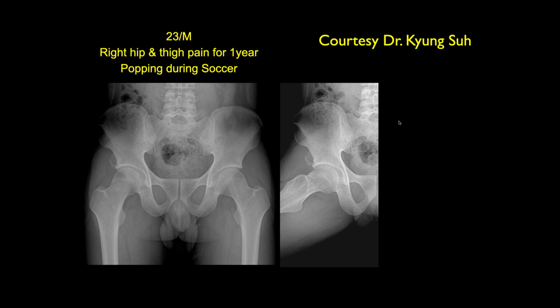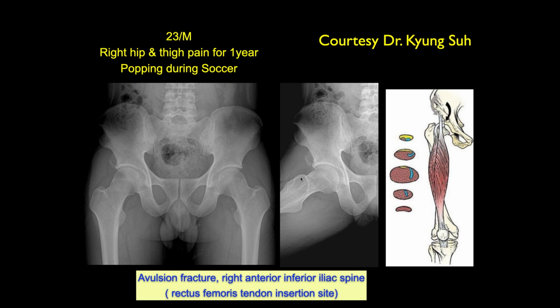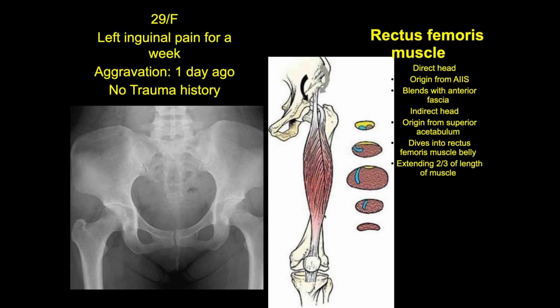So here we have a 23-year-old with right hip and thigh pain for 1 year and popping during soccer. There is some heterotopic ossification along that right rectus femoris attachment. This could reflect a remote injury with heterotopic ossification. Yeah, remote avulsion fracture. And then here we do see that ossific fragment. There's almost some fibrous scar tissue between where it avulsed from and the ossific fragment, but there's still some surrounding fluid and edema, so this is not stable.